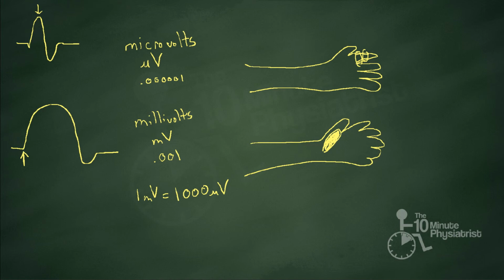But recall, this motor unit potential is the algebraic sum of a whole lot of tiny action potentials that are summed together to make this waveform. So you're really measuring the fastest conducting fibers here with the onset latency. With the sensory latencies, you are measuring a different population, sort of in the middle range of conduction velocity. So a little inherent difference. So why set that up differently? I think the reason is historical.